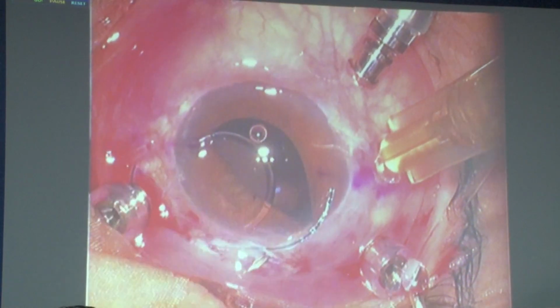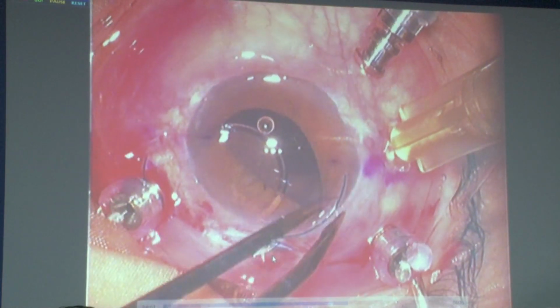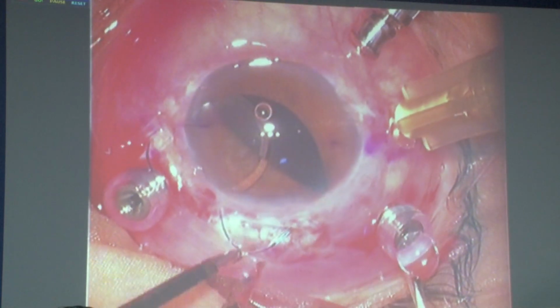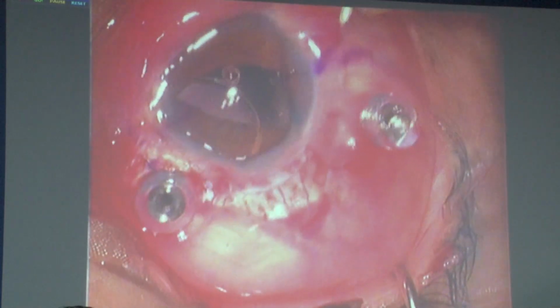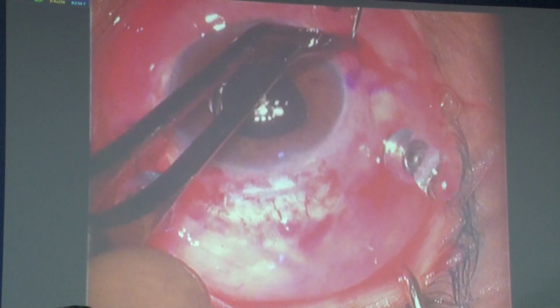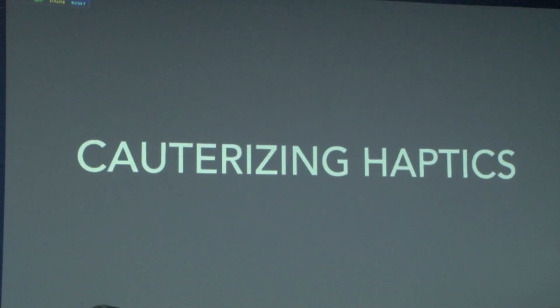So pull the needle to the extreme end of the tunnel, very gradually catch the haptic, and rail track into the haptic. Only 3 to 5 mm of haptic goes into the needle, and just pull it out, and that's it. The haptic won't go anywhere because it's an oblique tunnel which you have created.